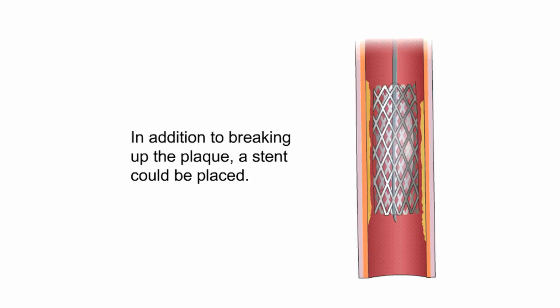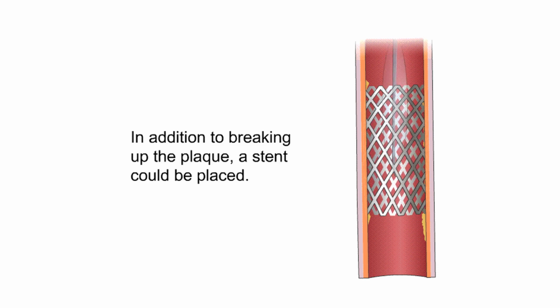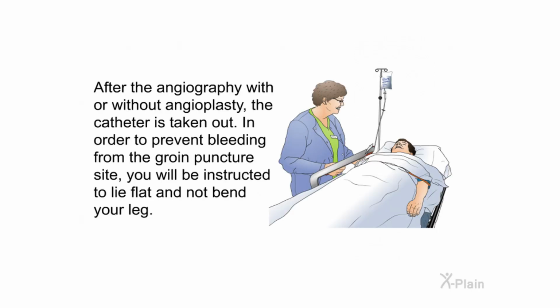In addition to breaking up the plaque, a stent could be placed. After the angiography with or without angioplasty, the catheter is taken out. In order to prevent bleeding from the groin puncture site, you will be instructed to lie flat and not bend your leg.